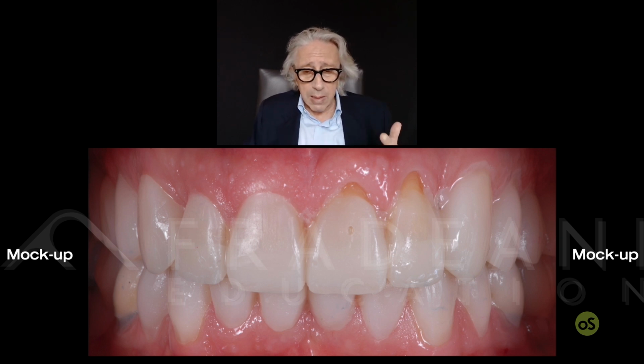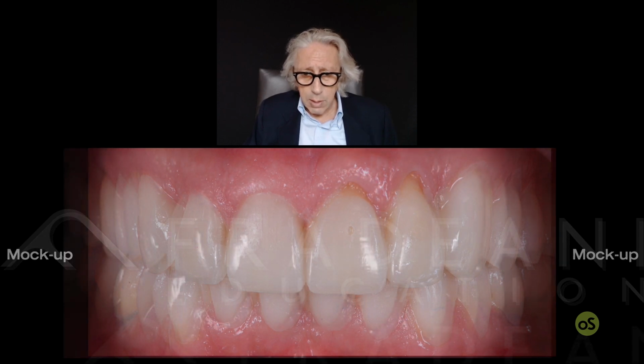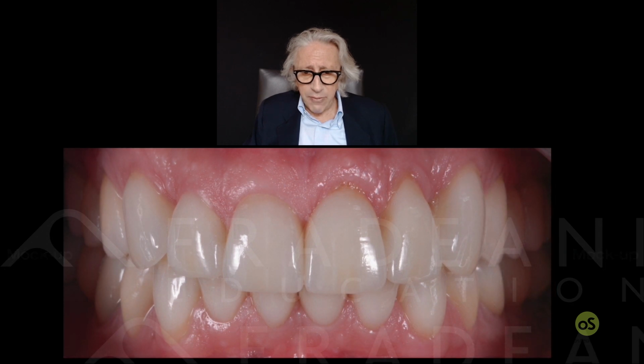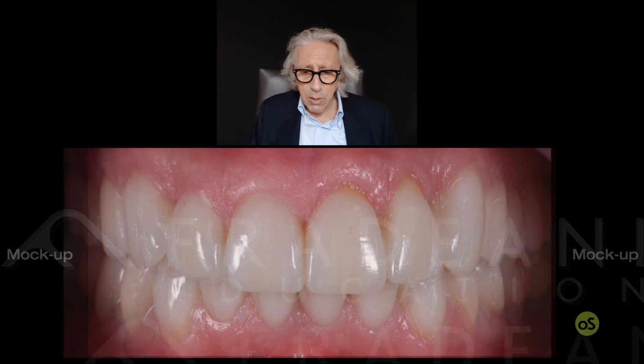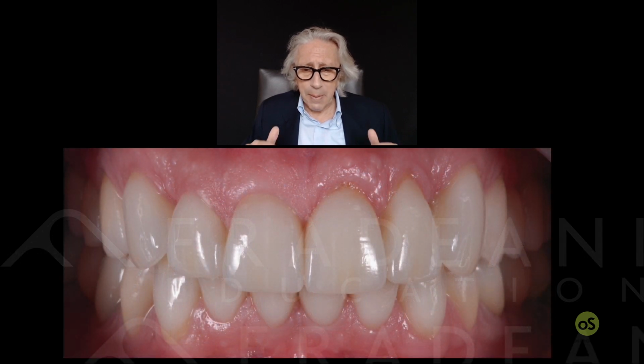And the question now is: are all the steps that we have seen able to let us copy this mock-up to the final? And the answer is in the next picture. Take a look. Position of the teeth are identical. But, again, we just changed the material. Look, identical length, identical position, all identical.